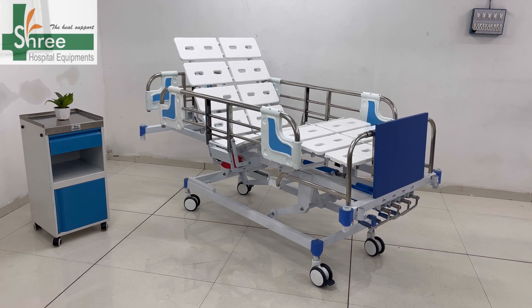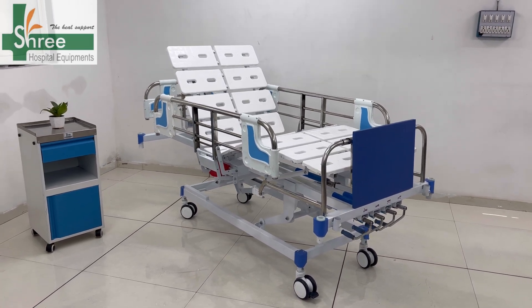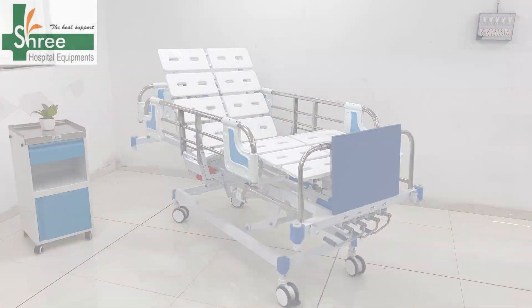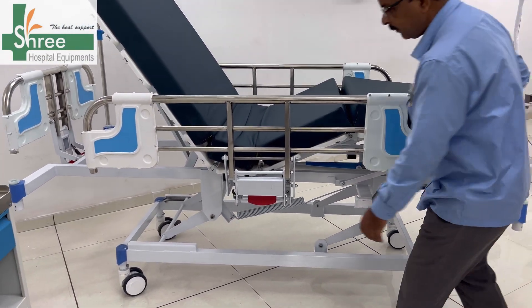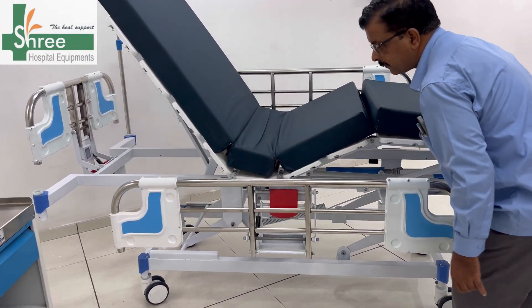This is the new Jupiter ICU bed by Sri. It has a combination side railing with the strength of metal and the aesthetic of ABS.